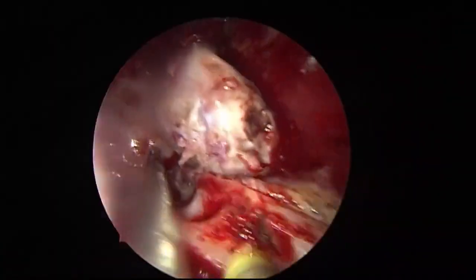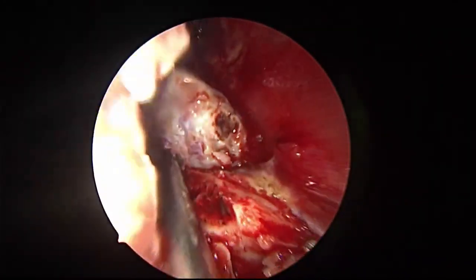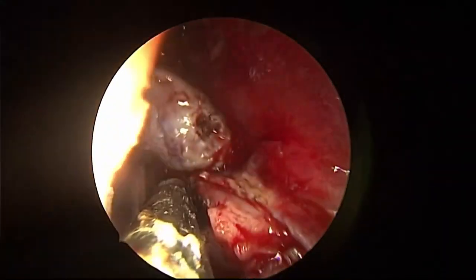Monopolar. Third. See some oozing from the bone. Can you see? Yes, sir. Clearly seen. Don't ruin your coblator. You can use monopolar.